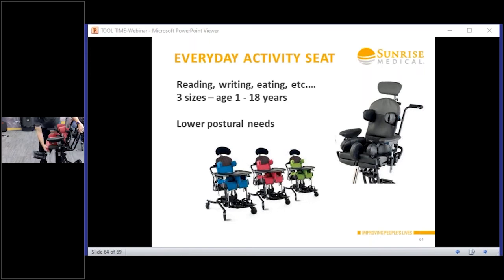All right, so Rob's just increased the seat depth by about 6 inches. Yeah, so just gives me that bit more. So the actual seat depth you can see is coming from the middle. It actually loses it from underneath the chair. So you're actually taking it from what was behind. So real visual, you'll be able to see what was here to know what you can grow to.